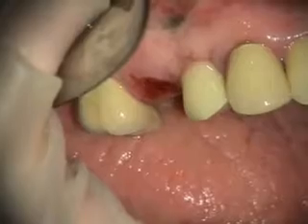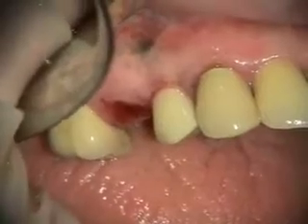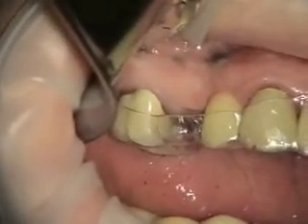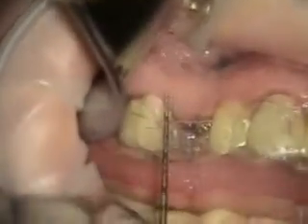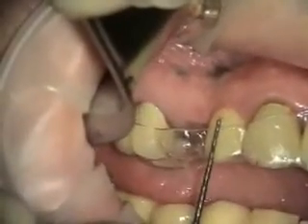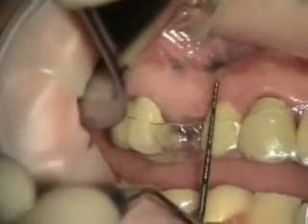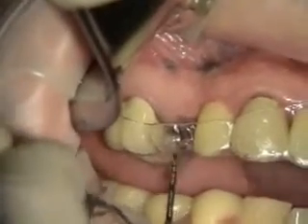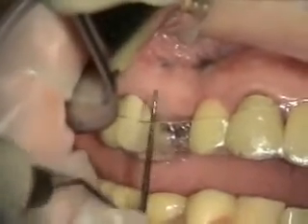We got our tooth out and the socket bone grafted. Then we placed another implant, did an immediate provisional, and it's out of occlusion. Previously she had a bridge from four to six. What we did as an interim was place an immediate provisional, take out number four, and bone graft the socket. That's healed, and now we're going to place the implant in the number four site.